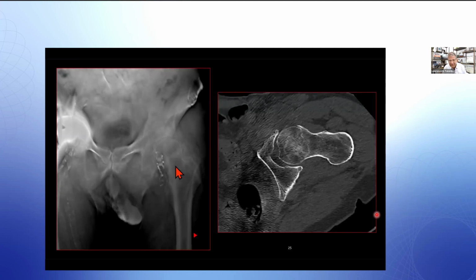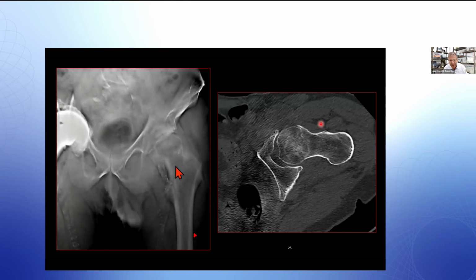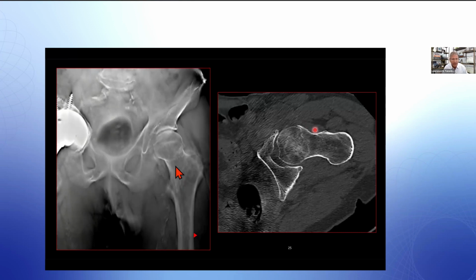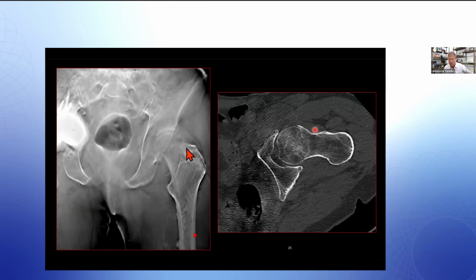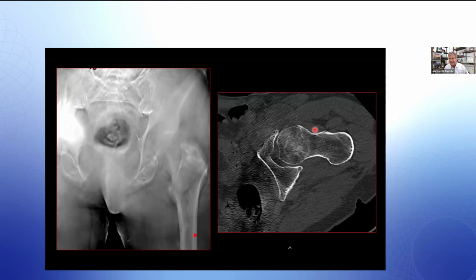And just to show you what the CT looks like, you can clearly see the offset at the fracture of the femoral head. And again, how nicely the tomosynthesis really demonstrates this finding without the need to get a CT scan, which may not be present in your office, which may require a several-week wait, which may not even be available in the near community where the patient is, and might require some transit.